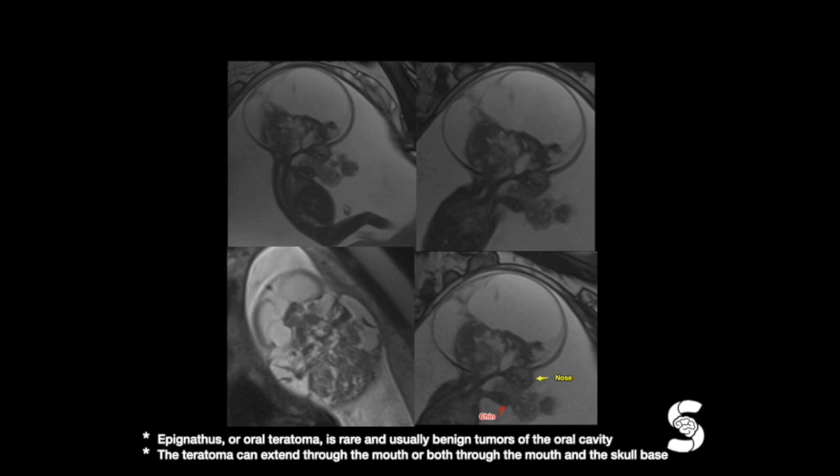This giant oral mass is distending the oral cavity and growing bidirectionally. Some part of the lesion is protruding into the amniotic cavity, and the remaining major part is growing and infiltrating the skull base and looking like an intracranial mass.